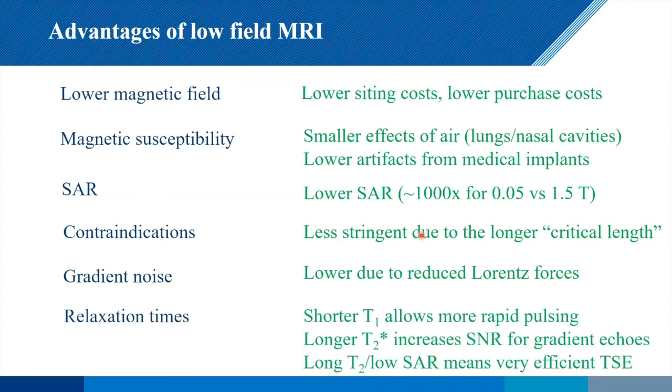And then, as NMR physicists here, we know that dipole-dipole coupled systems are going to have a shorter T1, and we're going to have a longer T2*, and a reasonably long T2, which means that our readout sequences can be much more efficient. We can do enormously long echo trains for TSE, we can do large spirals, things like that. So there's ways from a pure MR point of view to grab back some of that signal to noise. And of course, we're aiming at lower resolution, which in itself is going to give us some signal to noise per pixel back as well.